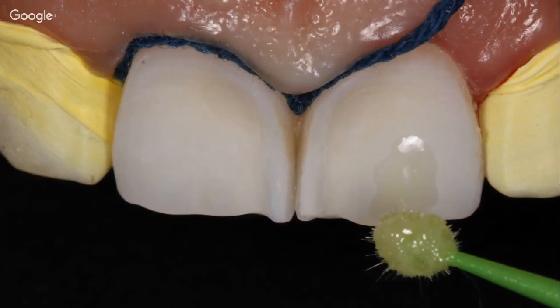The reason why you can't go back to working with your naked eyes is that when you got used to this amazing way of seeing teeth in big proportions with such clarity and really observing every step of your procedure and how it's being executed, you feel like the old way of working without magnification, the way you used to practice, is really bad.